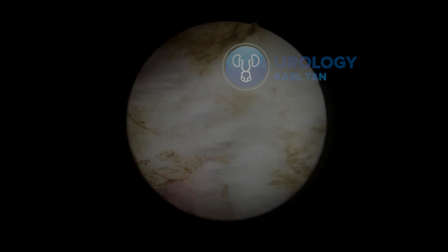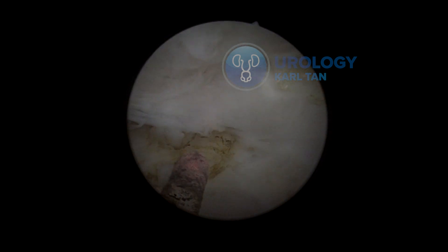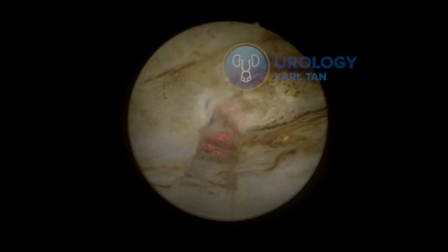We're almost there. The charring would be different — less compared to the usual if you're using the laser throughout the entire procedure. This will help you have less tissue irritation for the patient. I'm not sure if there are publications telling us that more charring leads to more irritation, but I think it's more related to the laser-tissue interaction between the thulium and the tissue.